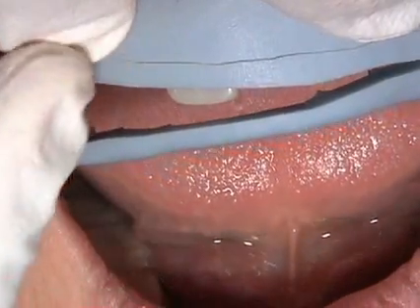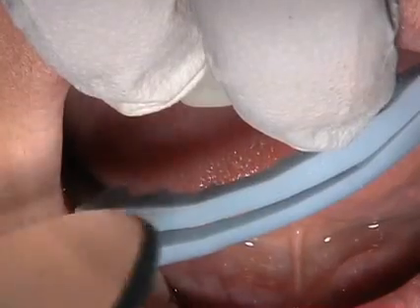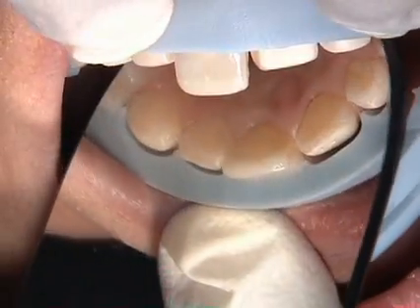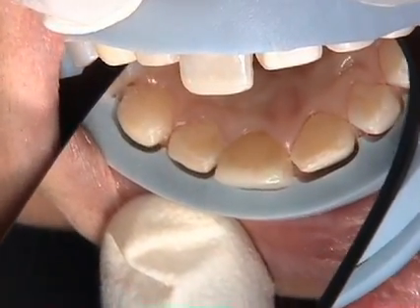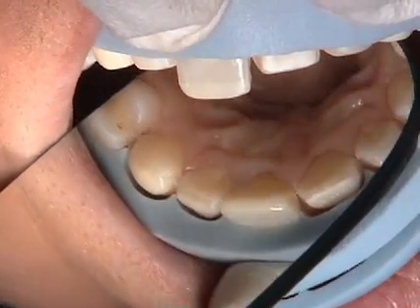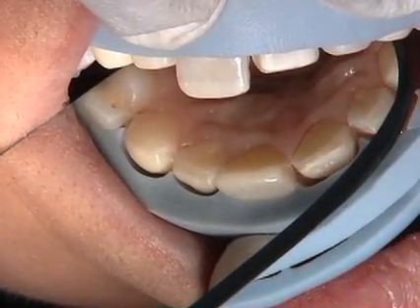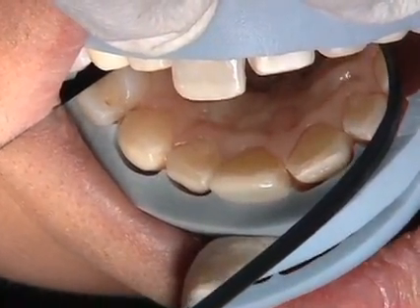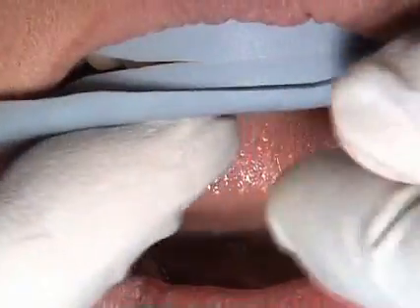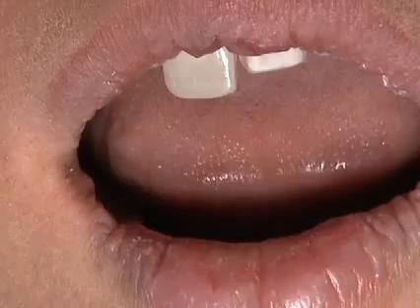If we retract the second part of the index, you can see there is a controlled reduction tooth-to-tooth. It's approximately 0.7 millimeters incisally, 0.5 millimeters mid-facially, and 0.3 millimeters as we go to the gingival aspect. This is a way to check that you have adequate reduction as you complete the facial aspect as well as interproximally.